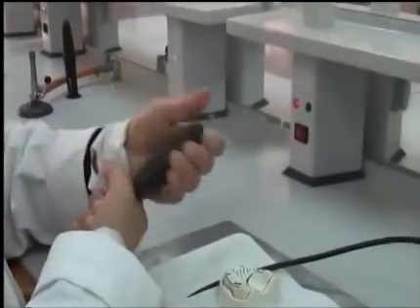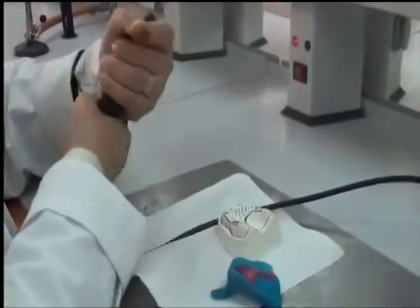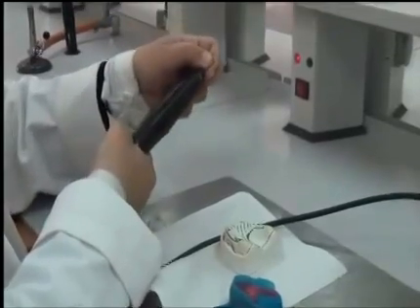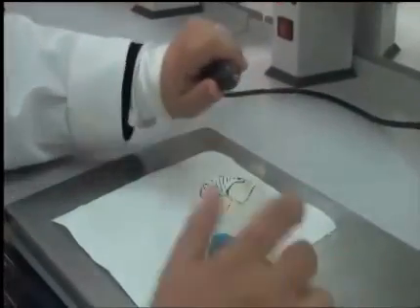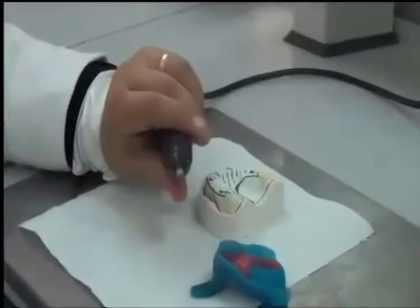To take the burr end out, you need to rotate the handpiece, put your acrylic burr in, and then secure it. You need to make sure that burrs are secured before working, because if they are not secured, they might come out and traumatize you. We're going to use the handpiece control unit that you have on your chair.